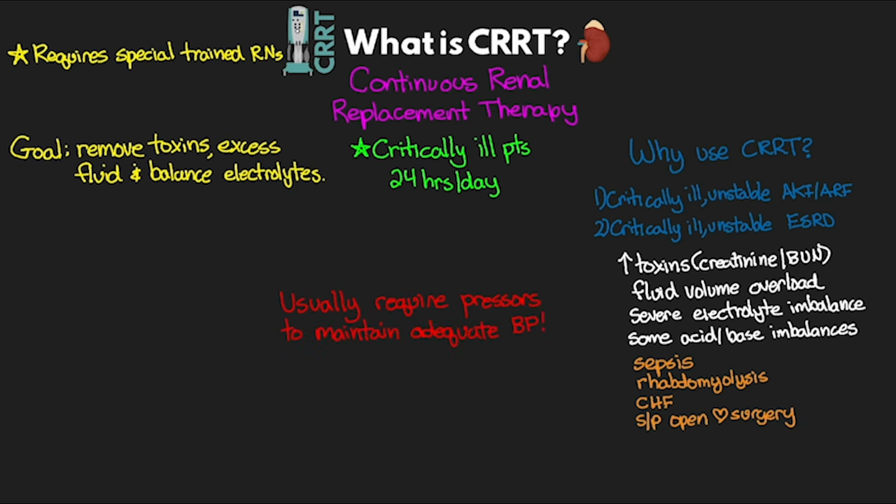And one of the really nice things about CRRT is that because it's continuously running, we can make changes to the therapy at any time. And so we can adapt to really rapidly changing situations that are being presented with these critically ill patients. So that's kind of the quick down and dirty on what CRRT is and why we're going to use it.